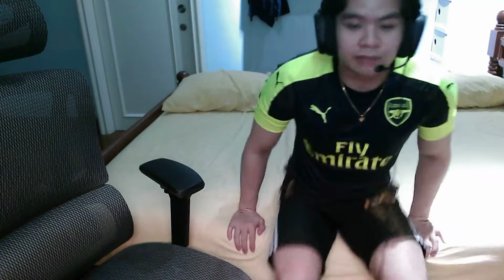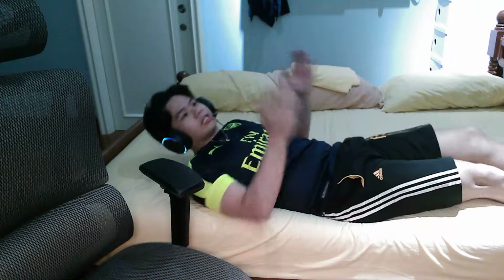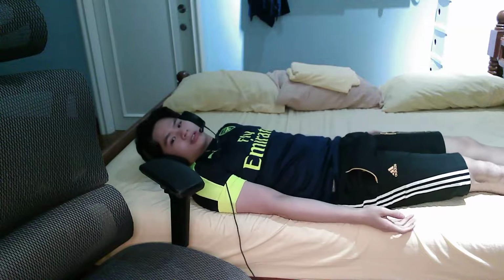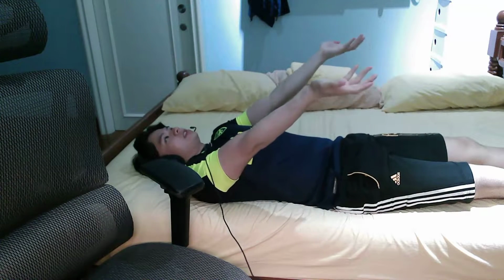How I'm gonna instruct the patient is basically, for example, if the patient's lying supine already, I'll have to instruct them like, okay, sir, so now that you're lying supine, what I want you to do is raise your arms up at an angle and have your palms face upwards.